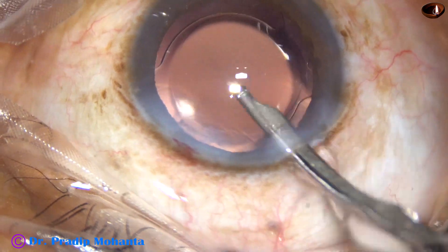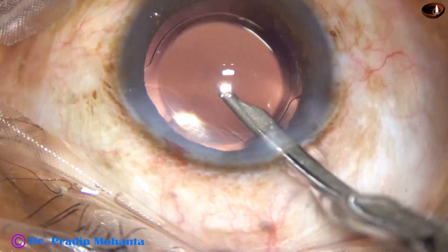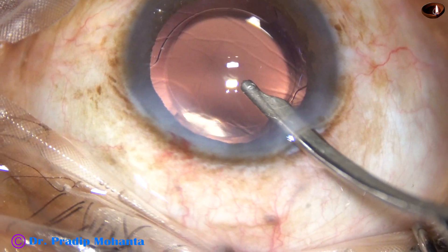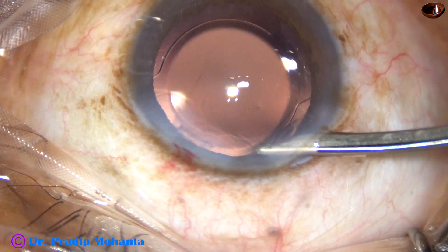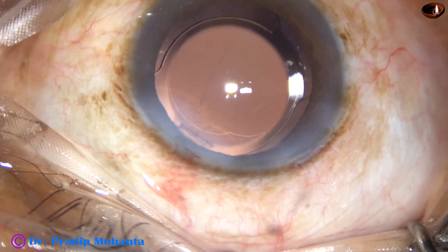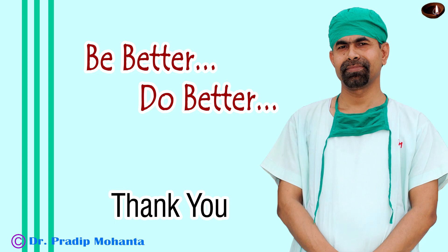In about 10 seconds you can clean the viscoelastic from the corneal endothelium very nicely. Now at 50% speed the chamber is nicely formed and the case is concluded. Thank you very much for your attention — I hope this video helps you in doing capsulorhexis, direct chop, and cleaning visco from the corneal endothelium very efficiently.